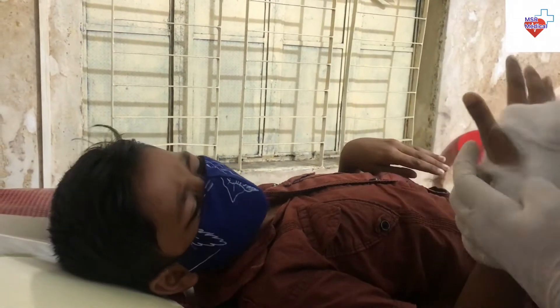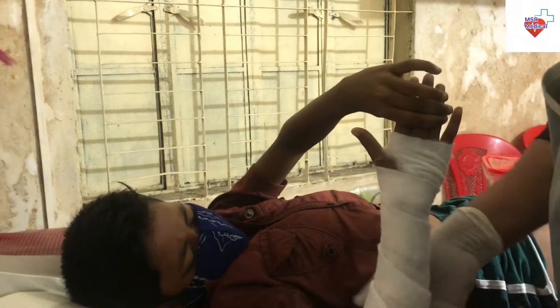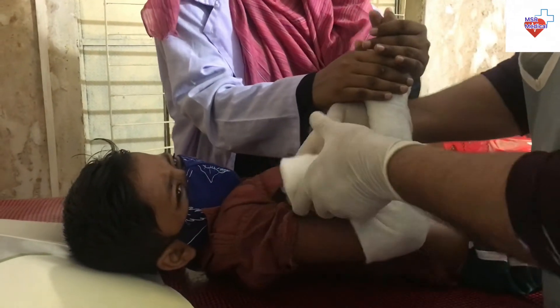Apply additional extra short segments of soft roll over the bony prominences of the elbow to ensure adequate padding. Avoid excessive soft roll anteriorly in the elbow crease. Wrap in a criss-cross fashion around the hand and wrist, tearing soft roll while passing through the first webspace.